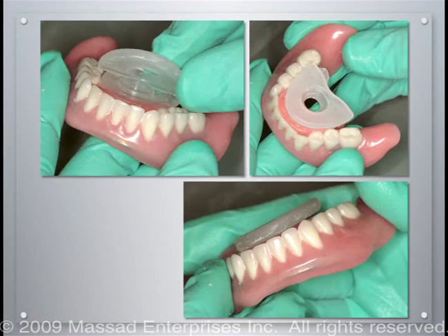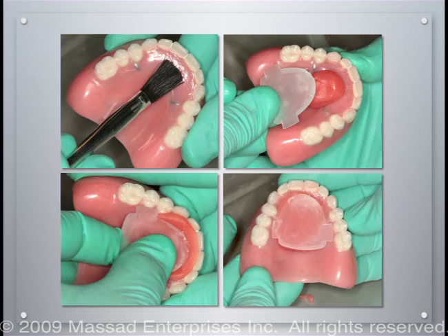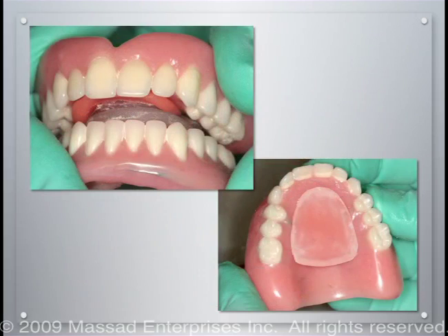Next, the spacer is placed on top of the pen receiver and snapped into position. Light cured bonding agent is applied to the maxillary arch to adhere the resin. Next, light cured resin is applied to mount the striking plate. It is now necessary to take the mandibular and maxillary denture, hold in position, allowing the spacer to align the striking plate and the pen receiver parallel with each other. Once this is completed, the maxillary striking plate is light cured.